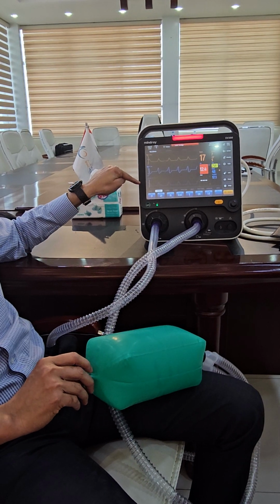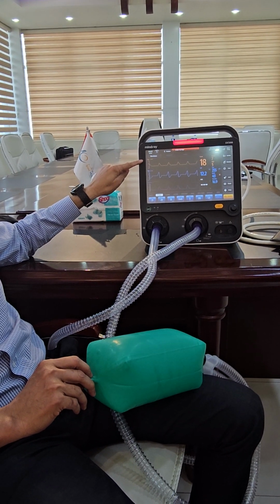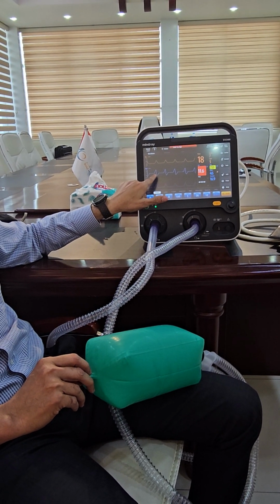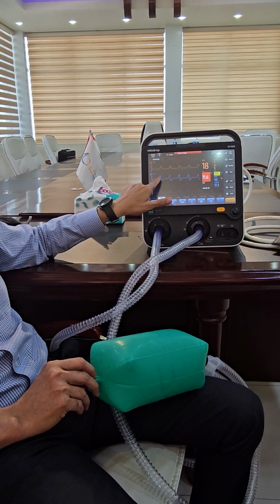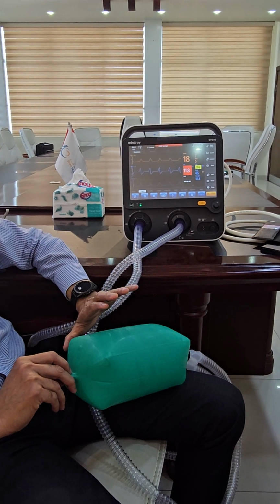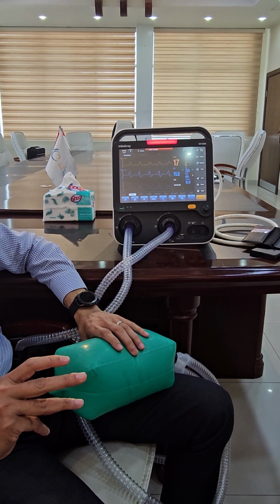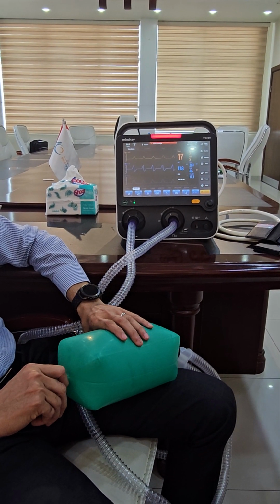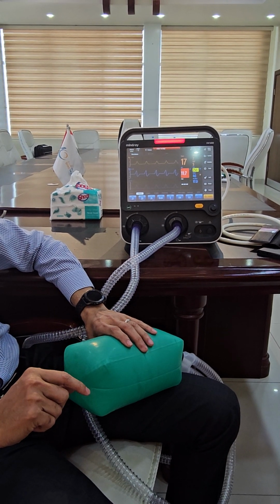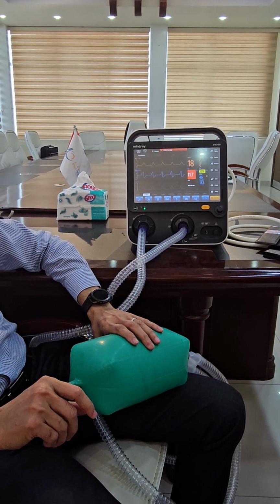And these are called graphics. The graphics include three parameters: flow, pressure, and volume versus time. And usually you see between 3 to 7 waves. So here's 1, 2, 3, 4, 5, all the monitors. Is that clear? So now we finished volume control and pressure control, and we talked about AC mode.